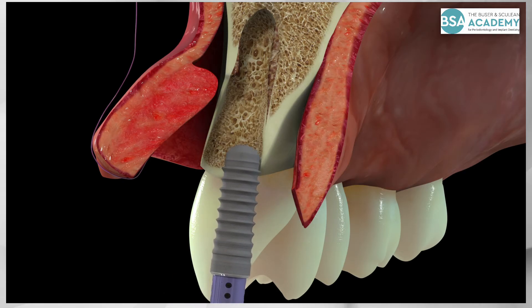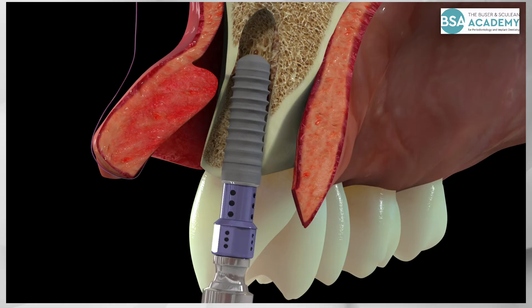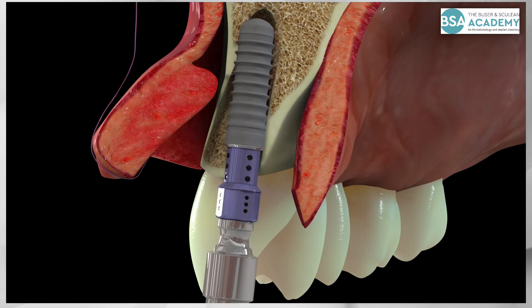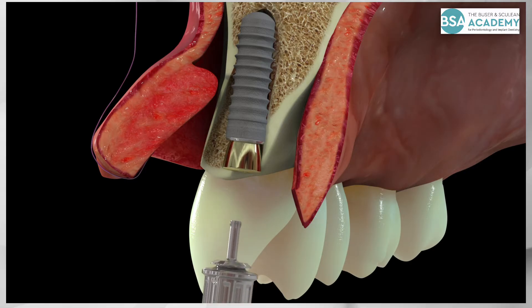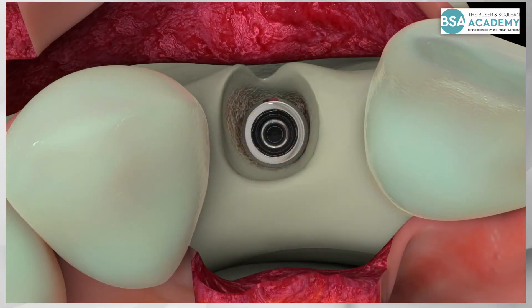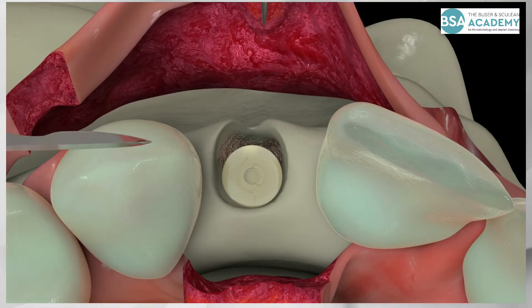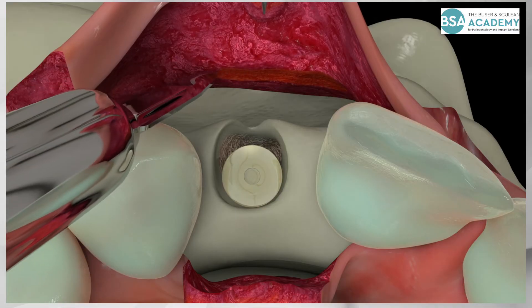The implant is inserted with a speed of 15 rpm without irrigation. The implant shoulder should always be located sub-crestedly in relation to the palatal wall. Depending on the local anatomy, a healing cap of 2 mm is inserted. The frontal view shows the correct positioning in the coronal-apical direction, having the implant shoulder roughly 3 mm apical to the mucosal margin of the future implant crown. The occlusal view shows the implant shoulder positioned about 1 mm towards the palate, with the exposed implant shoulder inside the bone, resulting in a two-wall defect on the facial aspect.